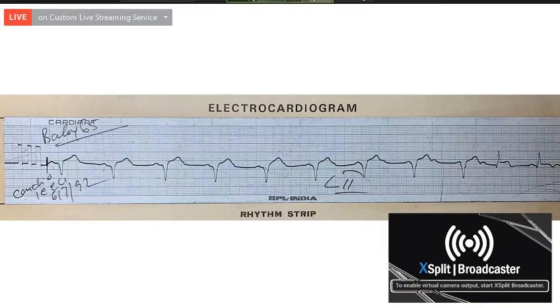Okay. You have to see from one end to the other end. What does this electrocardiogram show? Sir, 2:1 AV conduction, sir. Why did you say 2:1 AV conduction?